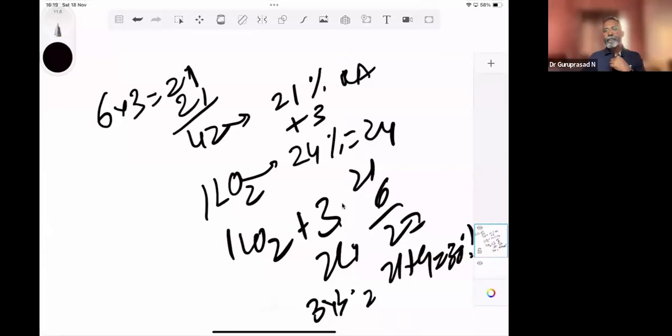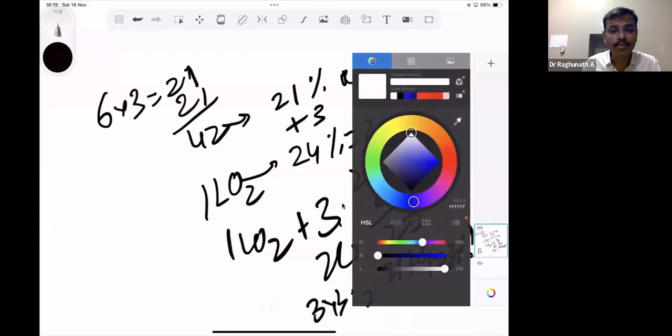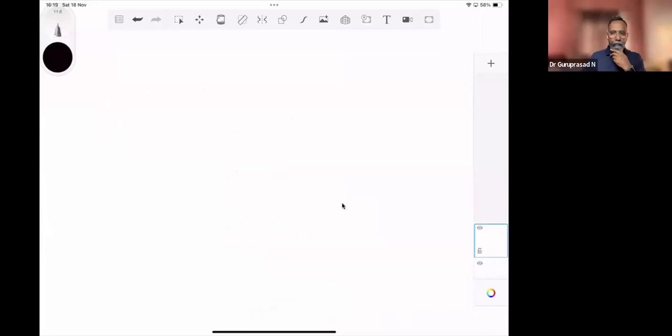Okay. So next question, Dr. Shashank, is it necessary to calculate validity when the machine itself is giving good values? There is no validity, no need. This is purely for your exam purpose, so that you know there is something called the Henderson-Hasselbalch equation. For that purpose, I have covered that part.